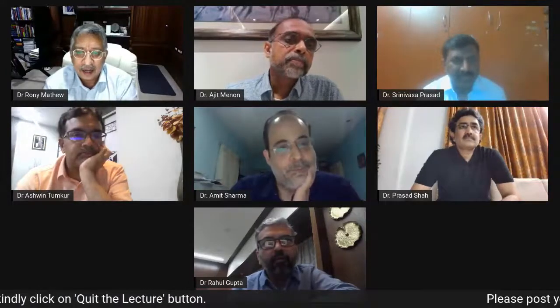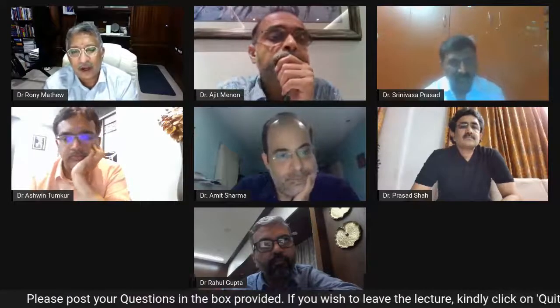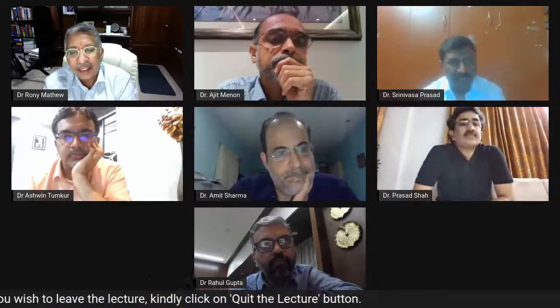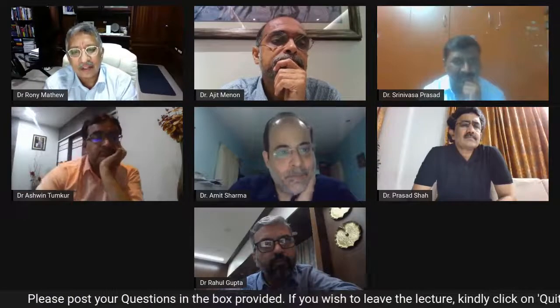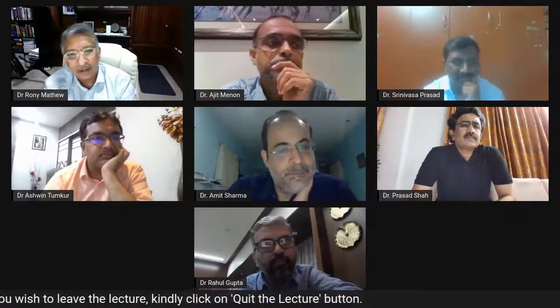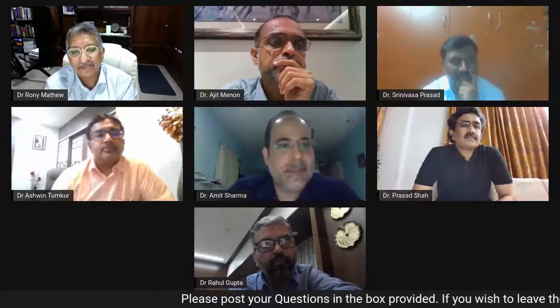and I think on the OCT, the mid-LAD showed a lot of eccentric calcium. And eccentric calcium, you cannot do it with a rota or an IVL. And I think what you did was excellent. Probably the only thing that I would do differently is look at the LCx scheme on the OCT from here and probably go and do a TAP onto the circumflex also, because I think the left main to the circumflex needs a little bit of opening, and you cannot open that in a POT unless you go and secure your circumflex.